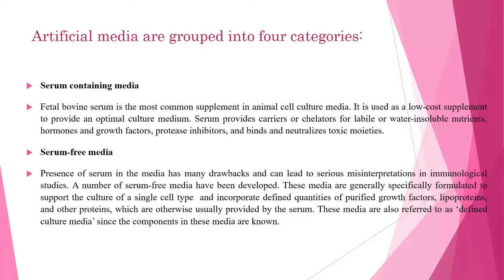So serum provides carriers or chelators for labile or water insoluble nutrients, hormones and growth factors, protease inhibitors, and binds and neutralizes toxic moieties. So you can see the importance and the functions of this serum in media. So the media which contain serum have all these properties. Okay, so they have the protease inhibitors in them, and also they neutralize toxic moieties. Okay, so such additional benefits are also there if the serum is present in the media.